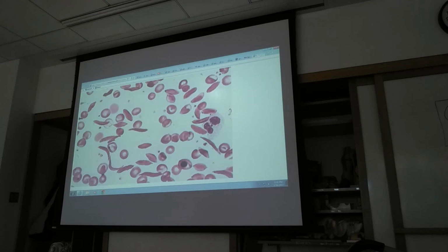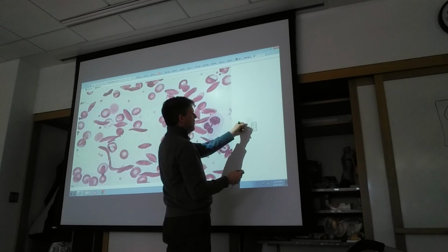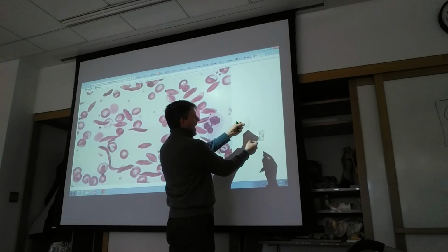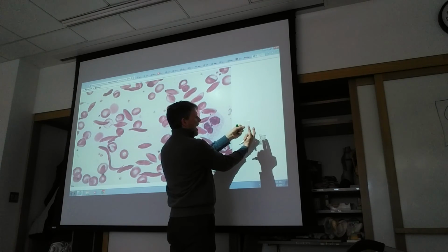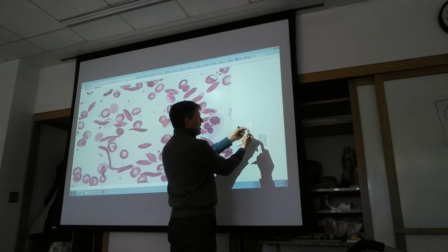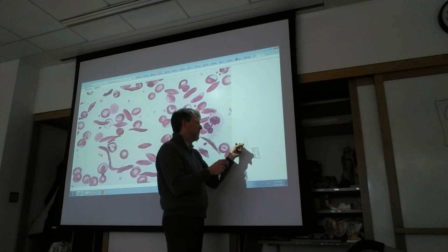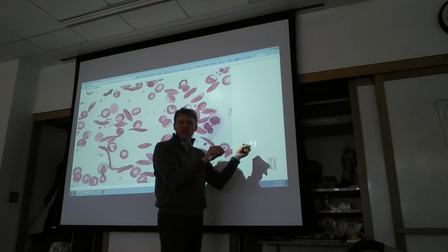When you're looking at this thing, sometimes it helps to put a sheet of paper with some words underneath it. If you see some clumping, it's really tough to read the letters underneath the test. Whereas if it's nice and clear, that indicates no clumping. You should be able to see the letters fairly clearly. If there's clumping, the fluid will get kind of cloudy in appearance.